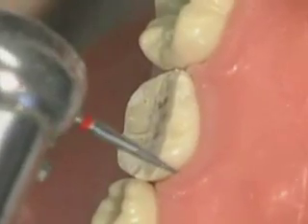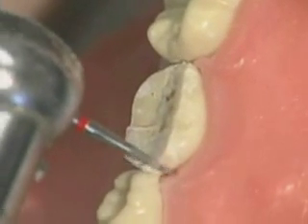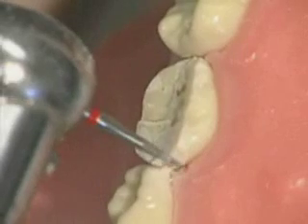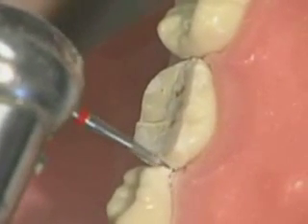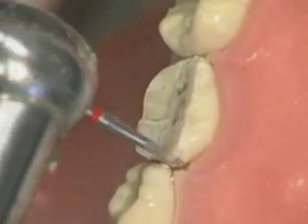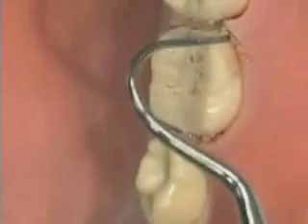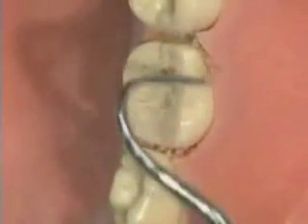Then switch the burr to a number 133F diamond. You want to slice directly through the proximal surface. Starting from the buccal surface, reduce or eliminate contact without creating a ledge in the proximal space or damaging the approximating tooth. Switch to the distal surface and perform the same procedure. Then use an explorer — in this case a perioprobe — and slide through the proximal surface to ensure that you don't have contact.